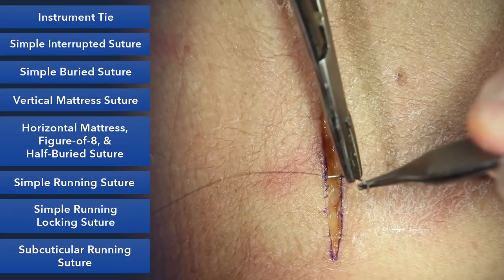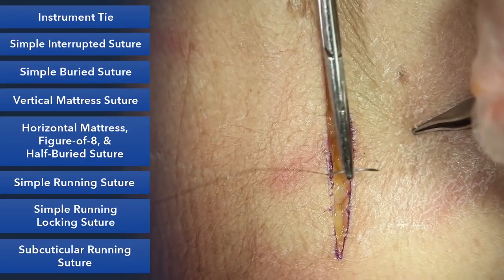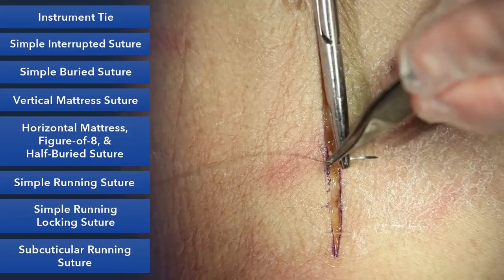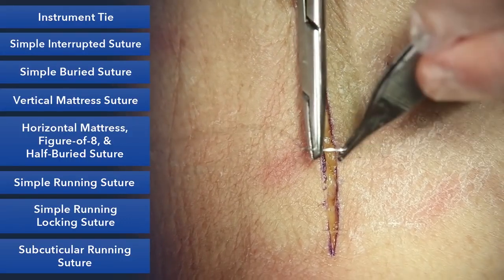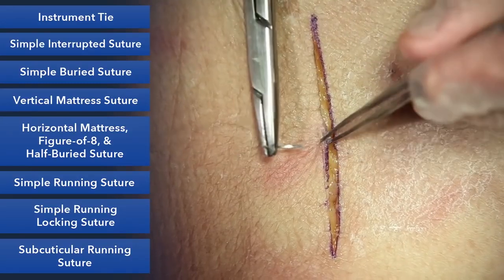Just a quick tip on handling the needle. You'll notice your needle has a flat portion in the middle — this is where you grab the needle with your needle driver. You don't want to grab it at the end where the suture comes in, or the swage, because it's round and you'll be unstable. Never grab the needle at the tip because you'll dull it.